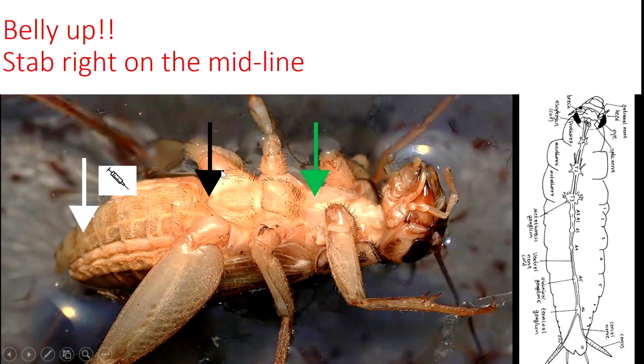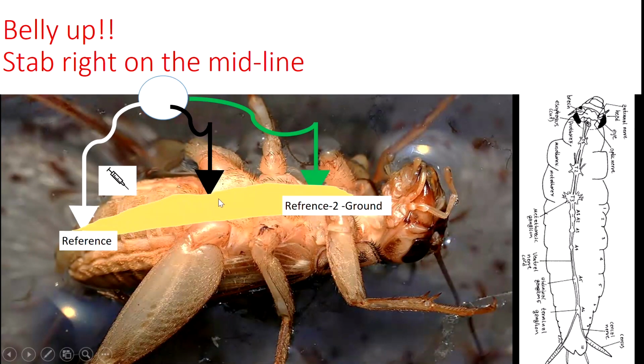So you're going to put 3 pin electrodes in there. We call them lead wires. And these lead wires are going to be connected to a machine called PowerLab. That basically functions as a multimeter, which will measure the voltage. So there's this big nerve here, and all these 3 pin electrode lead wires are going to connect to this nerve cord, which is this guy here.